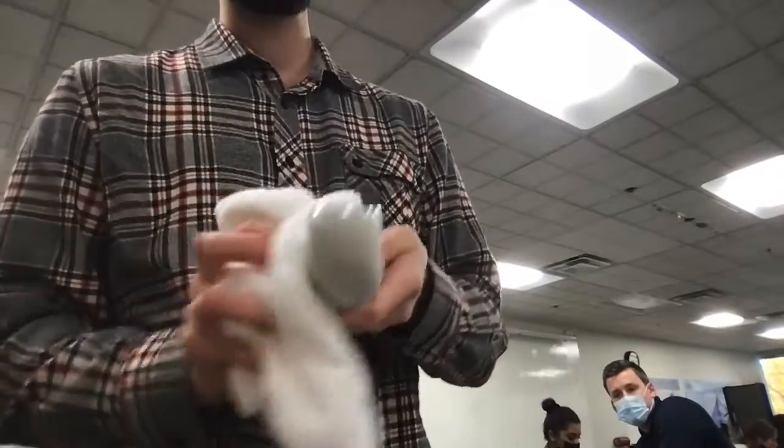Okay. So for the purposes of this video, we're just going to leave it on for about 30 seconds. I'll clean off the head here. Make sure to clean up my patient. Okay. Check the area. The skin looks good. And that is how you do therapeutic ultrasound.